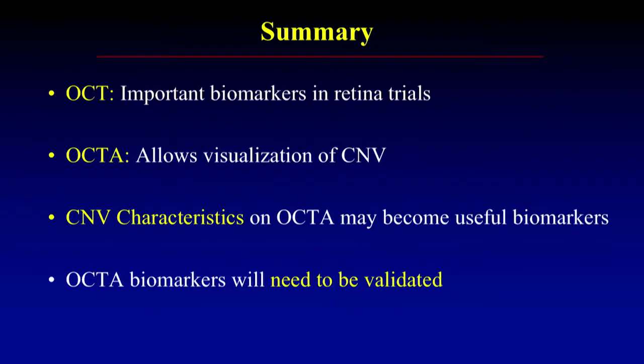So in summary, OCT has provided us important biomarkers in retinal trials in wet AMD. OCTA allows us to better visualize the neovascular membranes, and different characteristics of these membranes on OCTA may become useful biomarkers in future trials. But these biomarkers still do have to be validated.